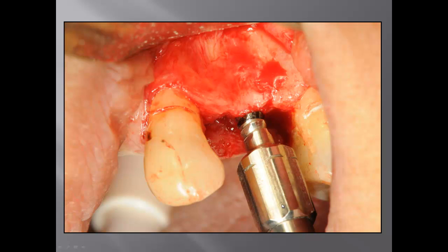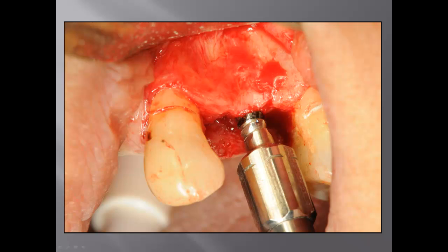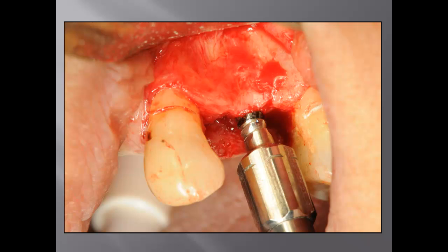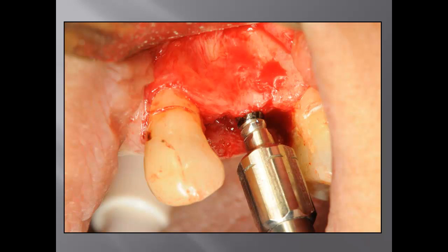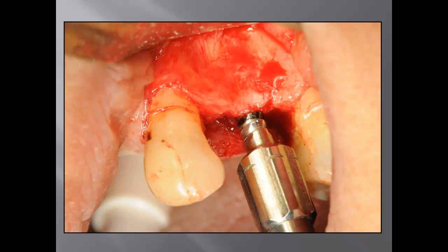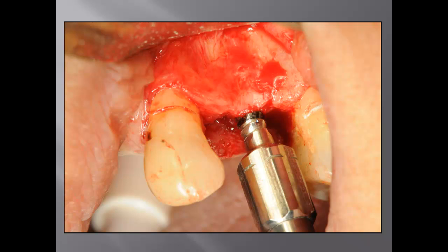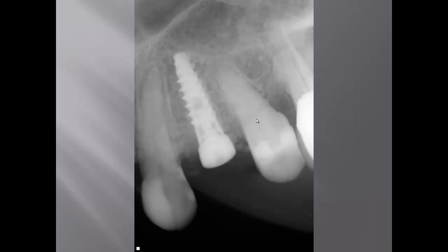I'm now using an expansion kit from Emis to improve the width of the bone and also improve the bone quality. The bone quality on this side is Type 4 — the bone is not very strong. By condensing and expanding the bone, I aim to improve its quality so that when I place the implant, I achieve a nice torque and good retention on the implant.